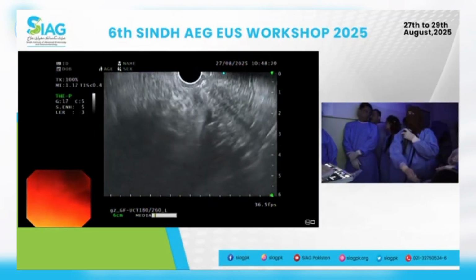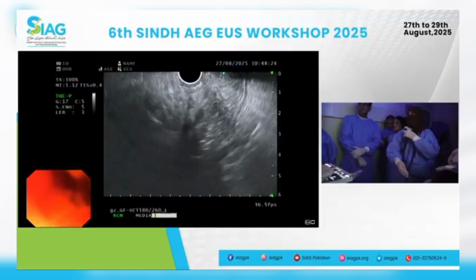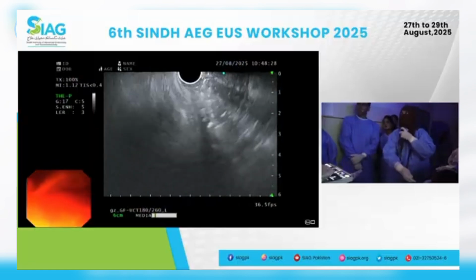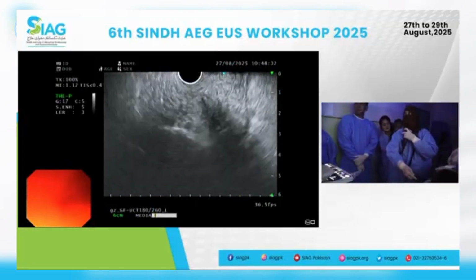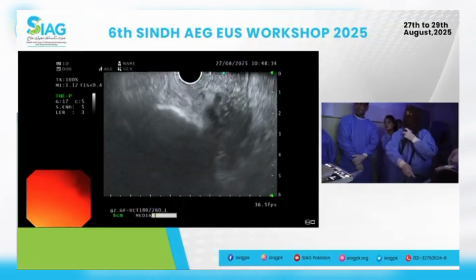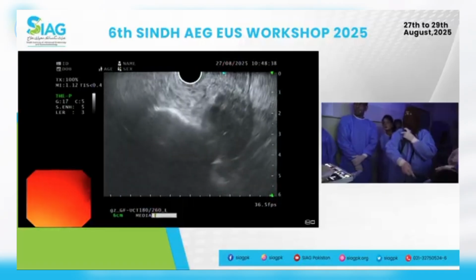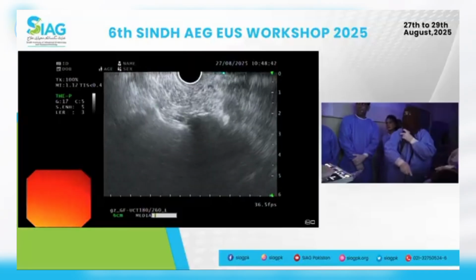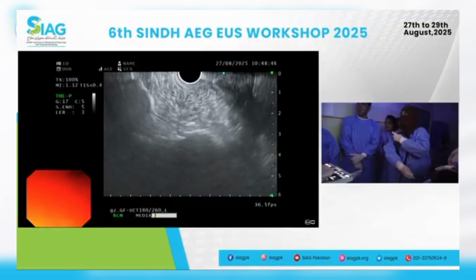Okay, that's fine. I'll give you one more minute to find the aorta. I will pull it back. Withdraw, withdraw. Clockwise, keep clockwise.